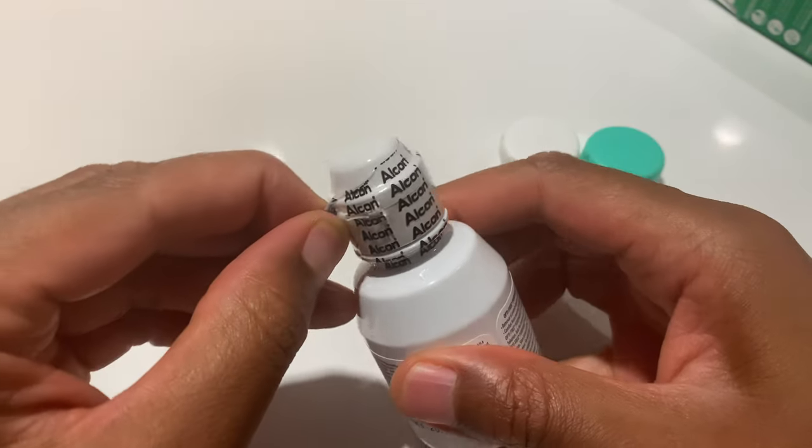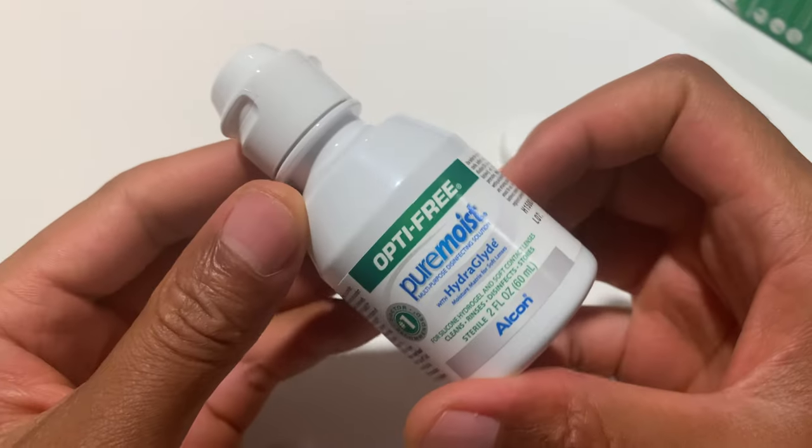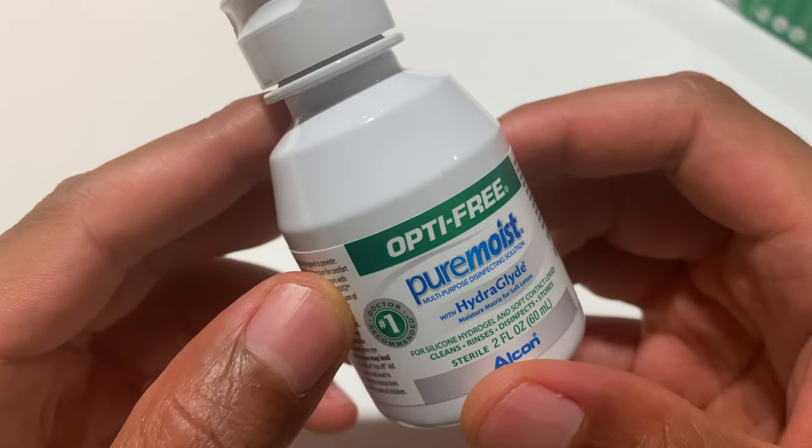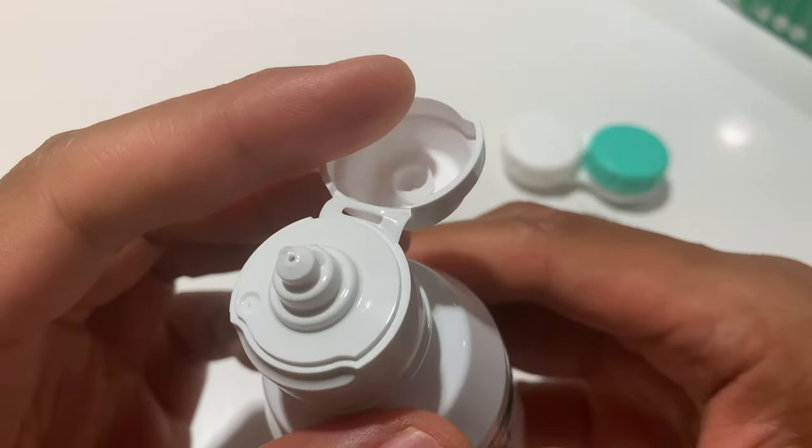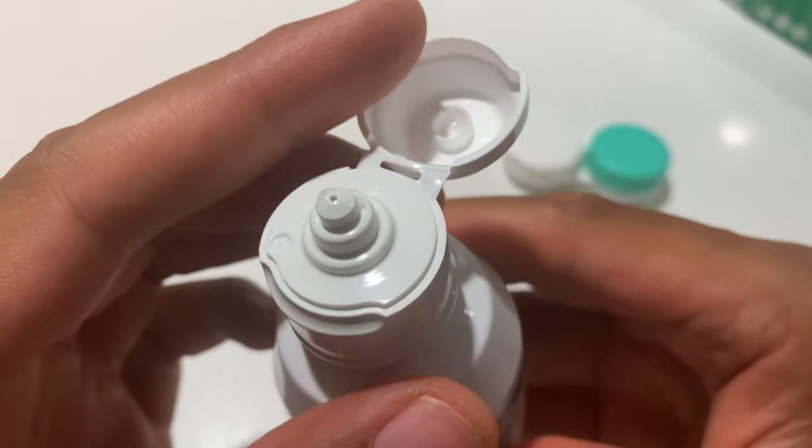I'm going to go ahead and take this open — this is the container right here. Alcon. Open the top. Solution pours out from the top right there.